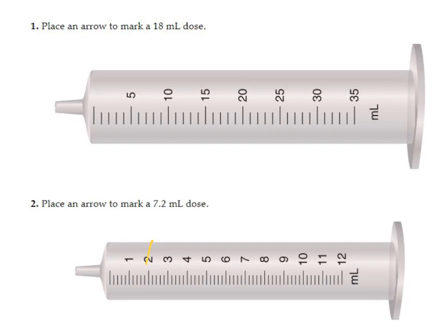So the first line behind the 1 is actually 1.2. The second line behind the 1 would then be 1.4. So there's the second line back there. The next one would be 1.6, this one would be 1.8, and that's why this is now 2. And we'd count in between all the other numbers the same way. So for instance, here's the 6.